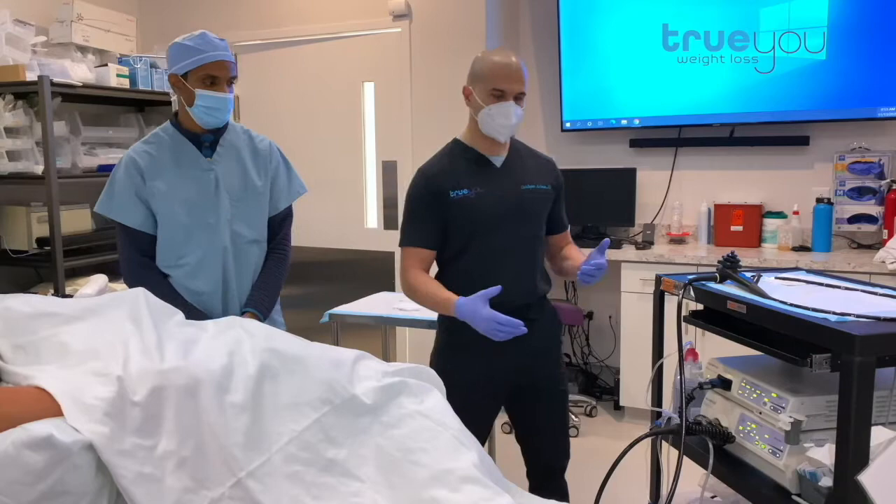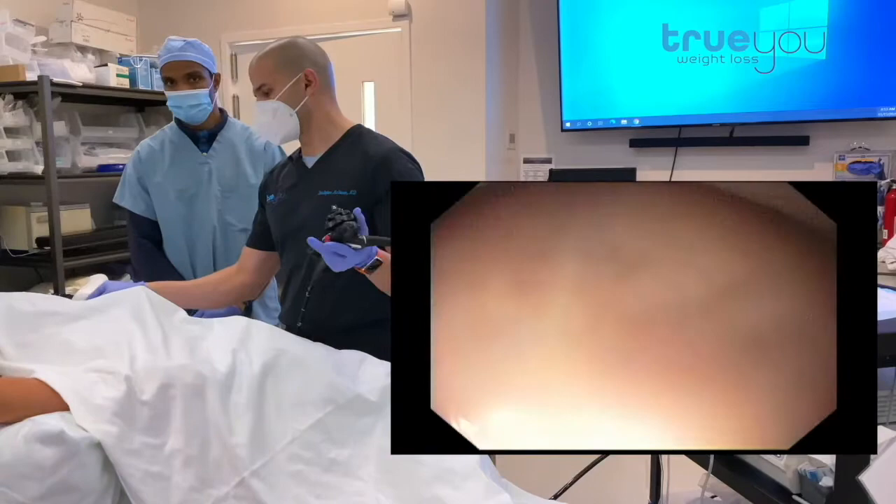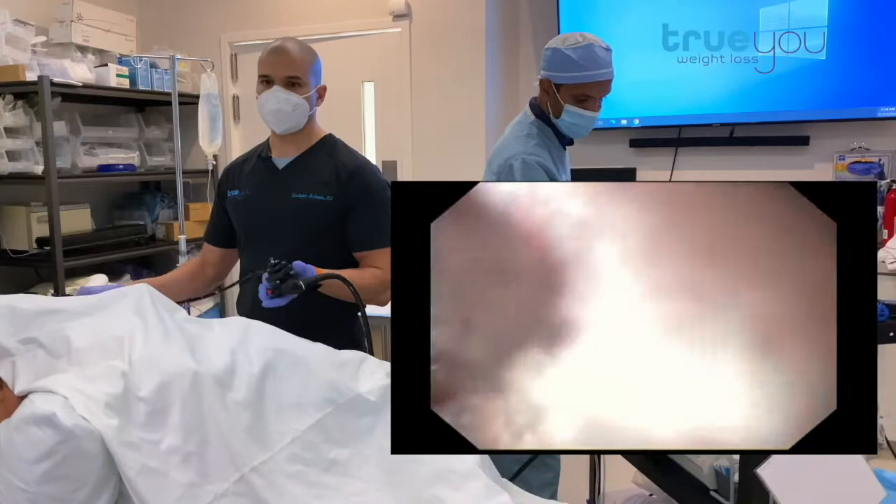The first step is we're going to take our endoscope and just evaluate the stomach — make sure everything's okay, nice and healthy, that there's no ulcers, a big hiatal hernia, or anything else that would prevent us from placing the balloon, which is quite rare. So we're going down the esophagus and I'm going to check out the stomach.